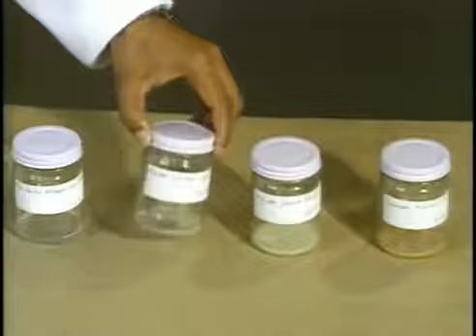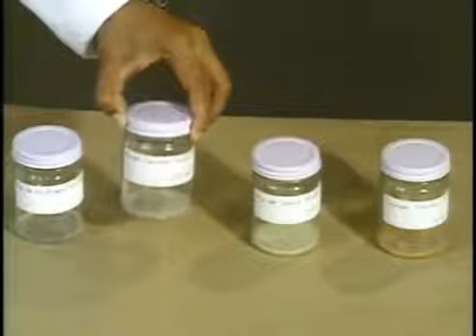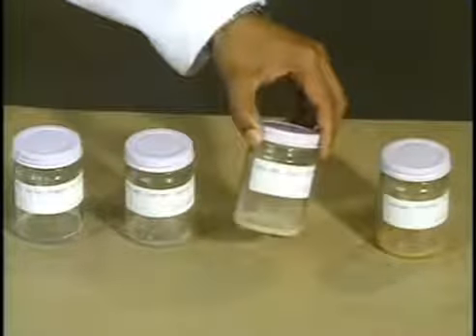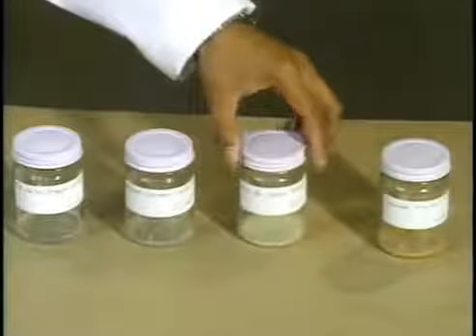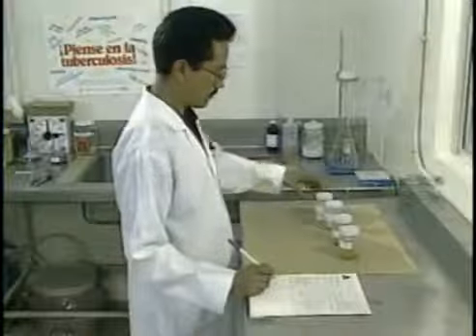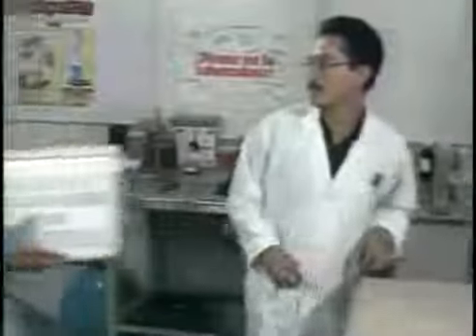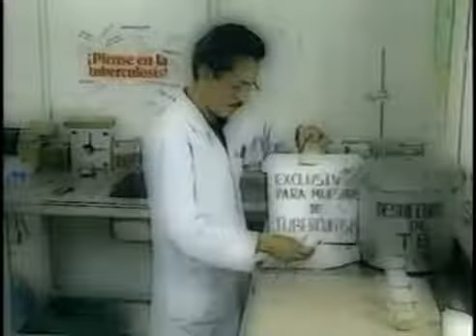A good sputum specimen should be 3 to 5 milliliters in quantity. It is frequently thick and mucoid, but may be fluid with chunks of dead tissue. The color may range from opaque white to green. Bloody specimens will be reddish or brown in color. Record the visual appearance of the sputum sample on the lab form. Always wash hands with soap and water after handling specimens and containers. Specimens should be packed and transported according to your country's NTP guidelines.